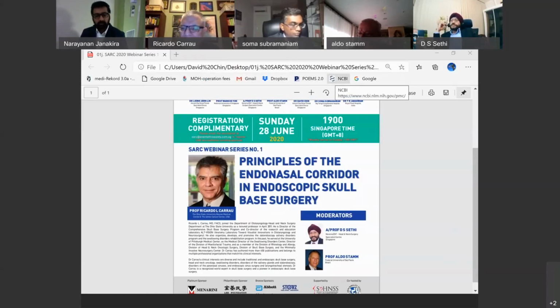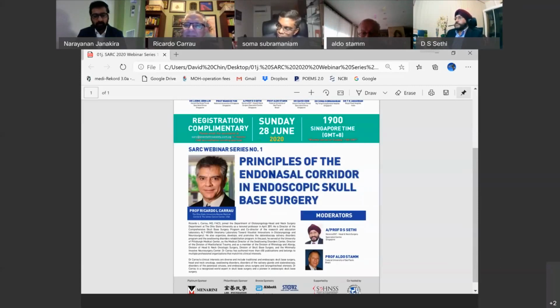Absolutely. Another very important comment for me is you mentioned in your presentation some instruments like a coarse diamond drill. The coarse diamond drill is really a very good drill, especially used for removing bone. I like the coarse diamond drill very much, for example, for frontal sinus operations like a Draf 3. So it works pretty nice. You need to remove the bone.